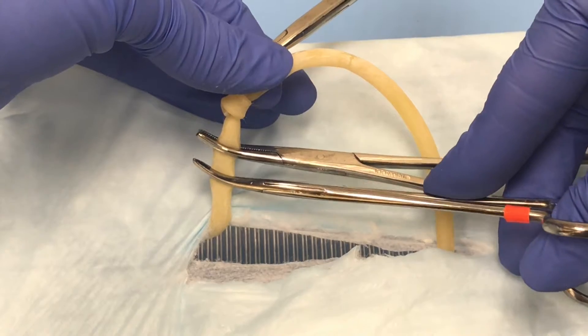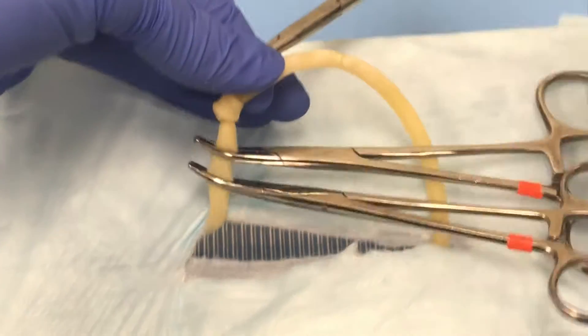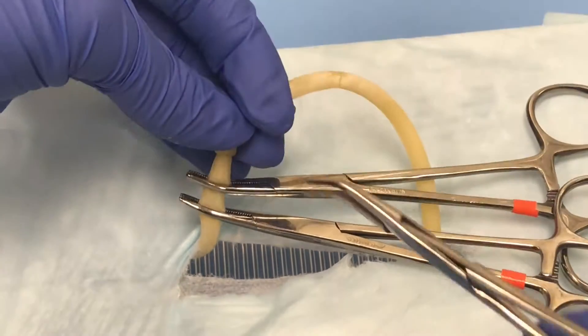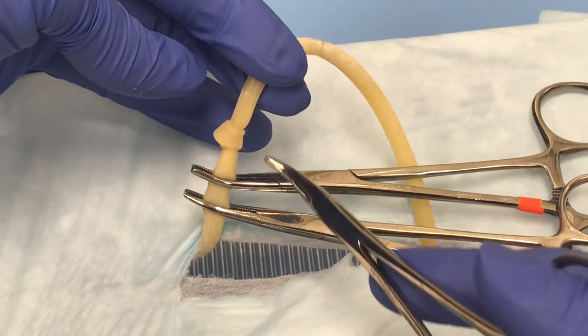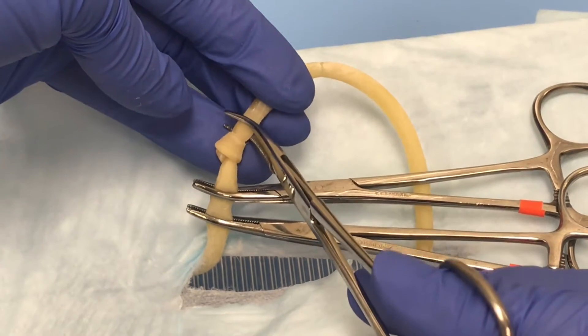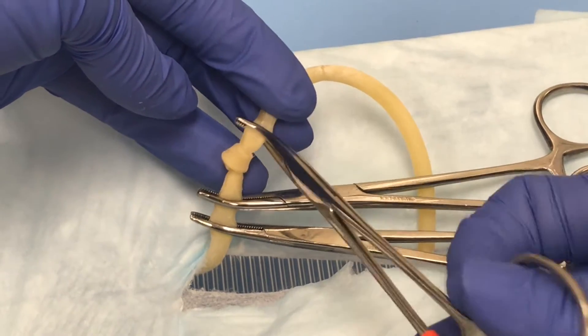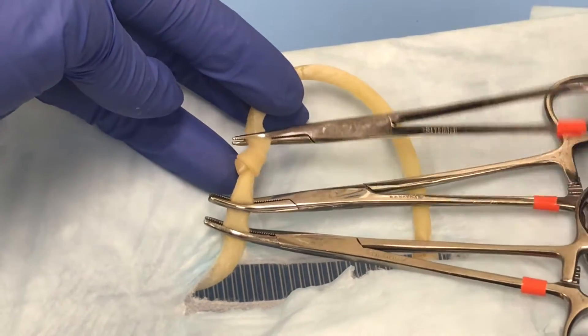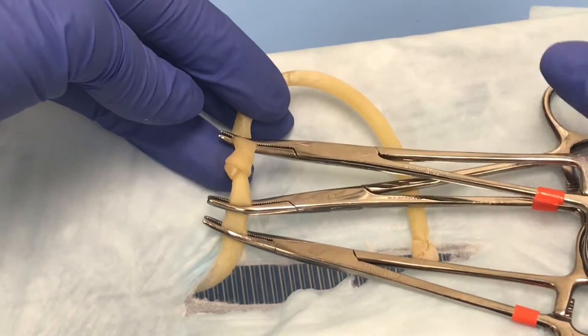You're going to place your second clamp there, and then you'll move this clamp through the window the same way you did the others, and clamp off that uterine horn so that when we cut this we're not going to have any back bleeding from the uterine artery or vein.